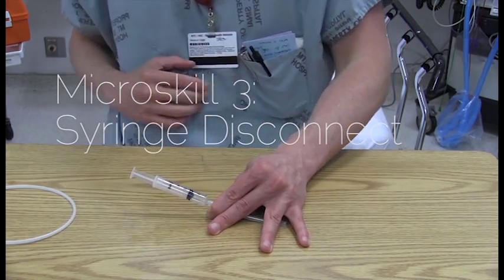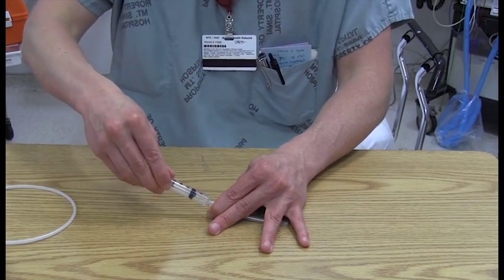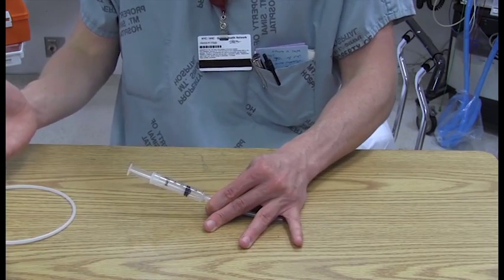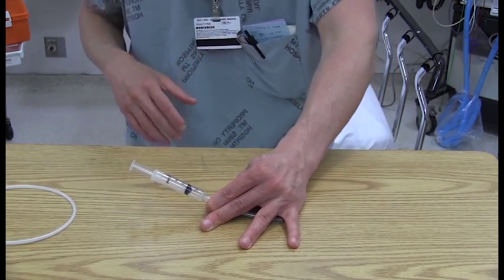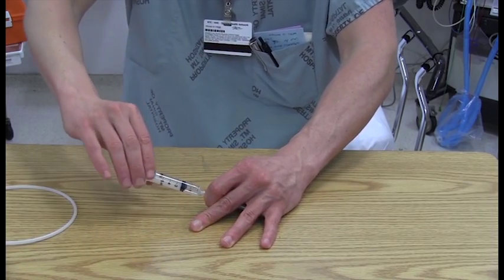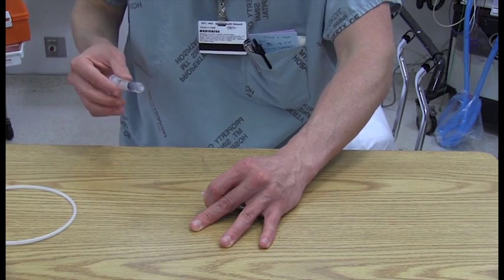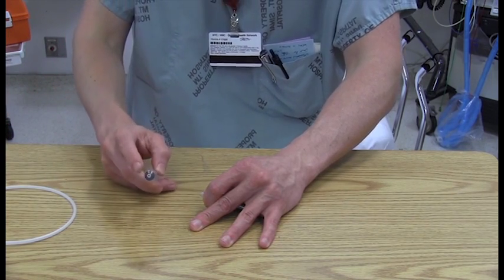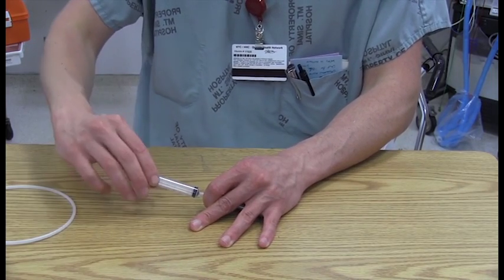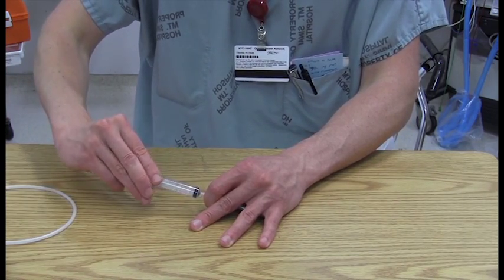That's the next skill. Now you might say, oh, this is easy, and it is, but this is where a lot of the slips happen, because inevitably it gets pushed in just a little bit, or it gets pulled out just a little bit, and that's enough to dislodge the location of the needle tip. So you have to be incredibly tight, holding it, ready, and now it's actually a twisting motion. People seem to think that this is the Luer lock on these, and you should not be using Luer locks in general. You should just have a slip. So it can just be a pull, but I find it's a lot harder to disengage that. So I always just do a little twist.